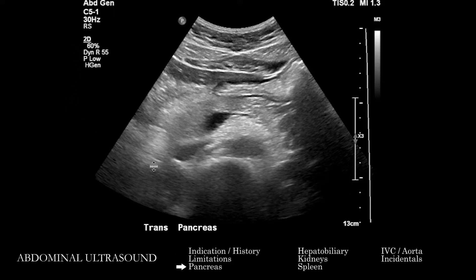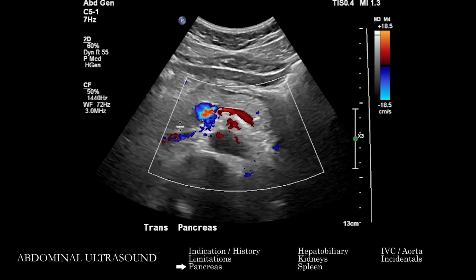At our institution, it's not uncommon for the pancreas to be imaged first. We want to get a sense of the extent to which we actually see the whole anatomy of the pancreas. Frequently we don't see the tail or deeper aspects, and it's not common to see pancreatic pathology. But sometimes, correlating with the color Doppler images, you can see a prominent pancreatic duct, pancreatic lesions, or changes in echogenicity. It's pretty uncommon to pick up mass lesions on ultrasound, but it's something to scan for.